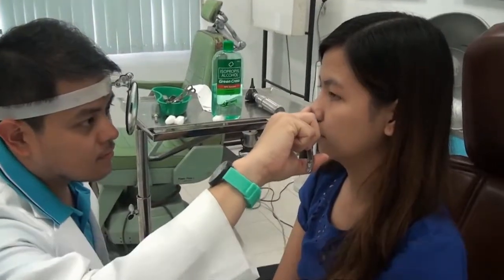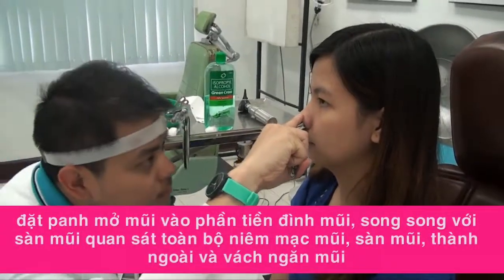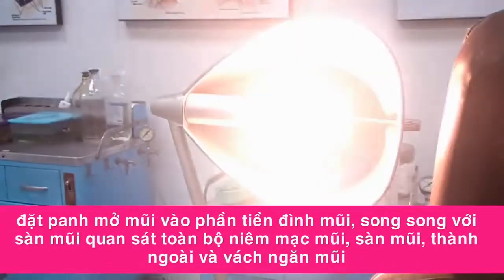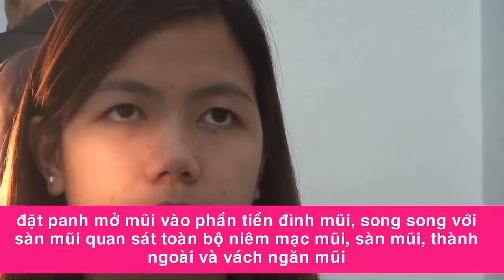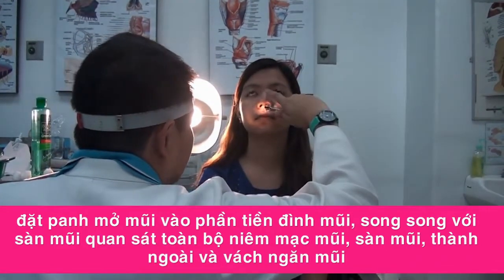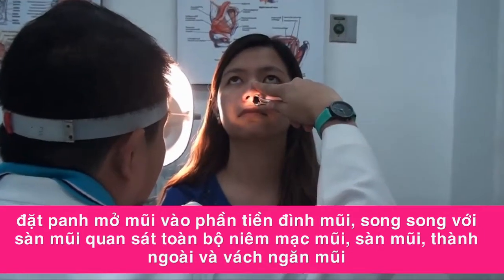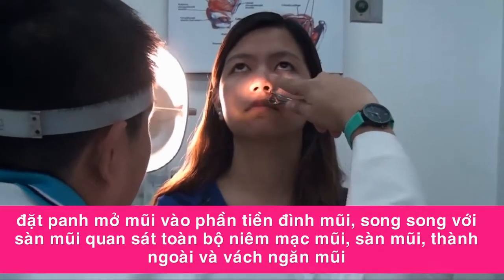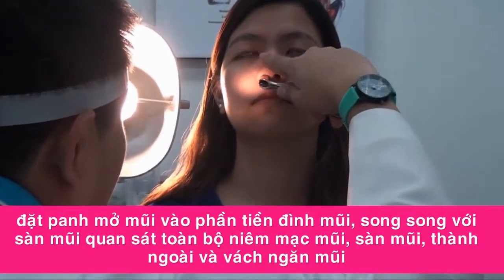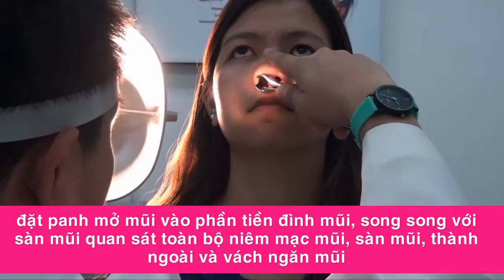Evaluate the nasal vestibule and anterior nasal cavity using anterior rhinoscopy. Make sure your head mirror and light source are properly placed to provide adequate lighting. With the patient in a sniffing position, hold the speculum properly while bracing with your index finger. The speculum is inserted with blades closed and carefully withdrawn with blades slightly open. Avoid discomforting the patient at all times.